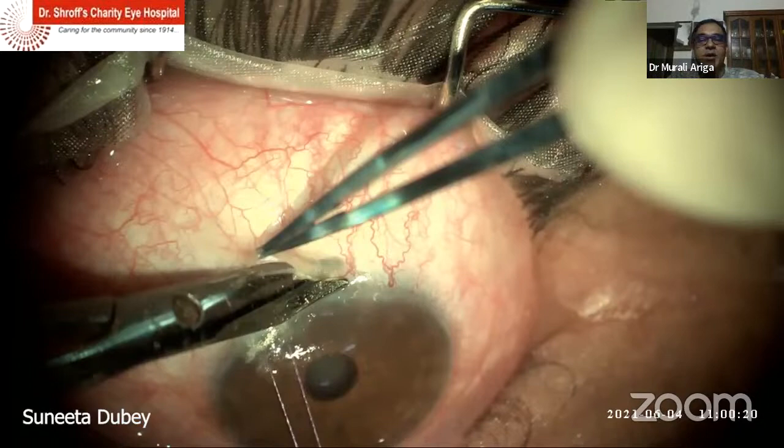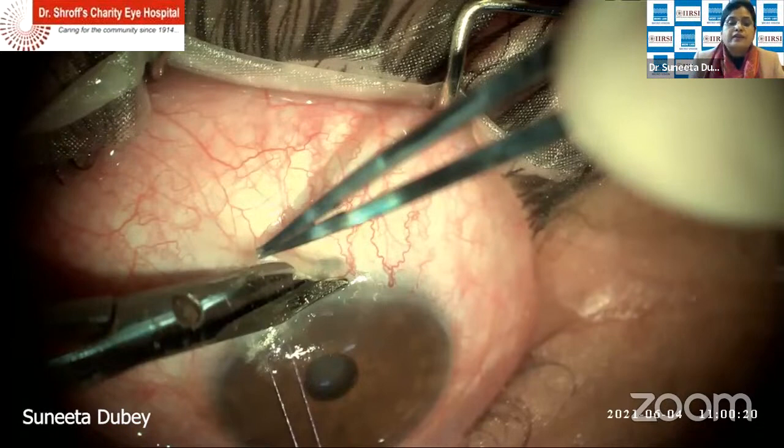I always do it exactly at 12 o'clock because I can do something later supranasally or supratemporally. And invariably, they end up with a cataract surgery later, so the temporal cataract surgery is always left alone. So the superior actually works best for me. I agree with you, Dr. Arora, that superior, as mentioned now in literature, is the best. It is most comfortable and the chances of infection are also less. But if you have to perform another tube implant, then you can go temporally or nasally, superonasally. See, we have four to five clock hours.